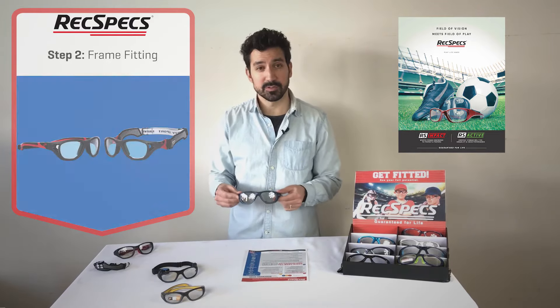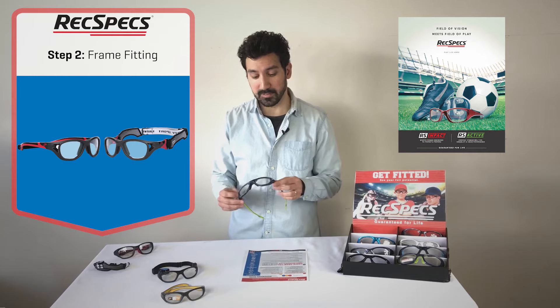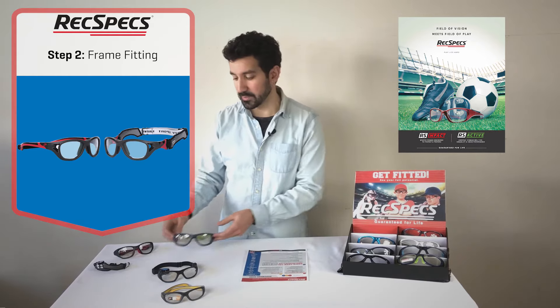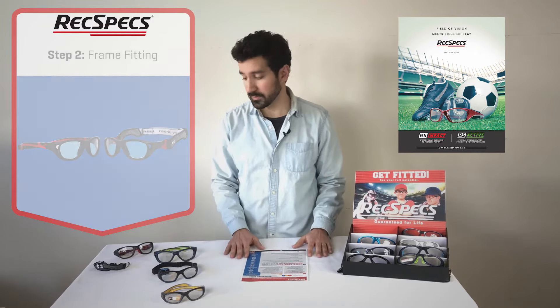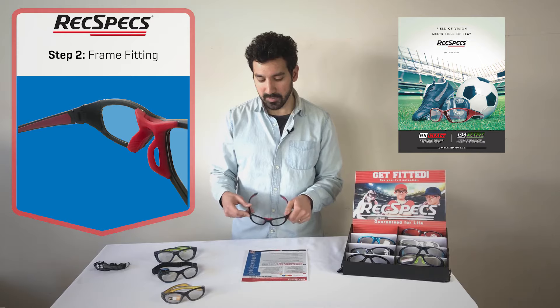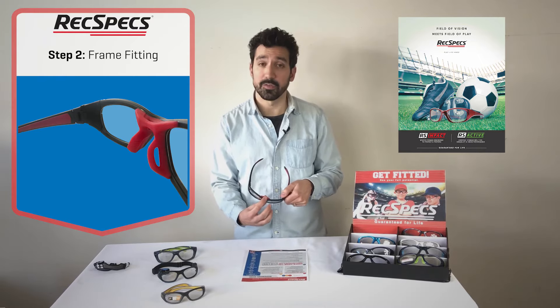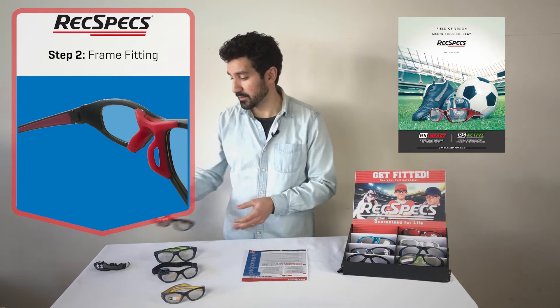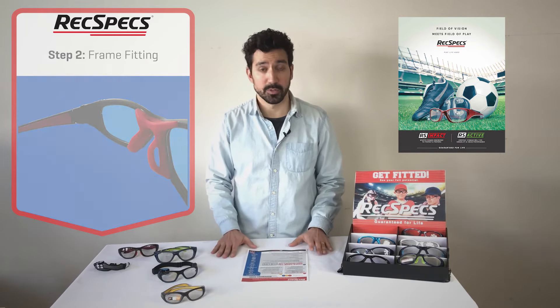Here we have our interchangeable style. This is quite versatile because it serves as both a frame and a goggle for patients that participate in multiple sports. And then lastly here we have our low bridge fit. This has raised padding here around the nose bridge which actually helps keep these frames propped up on your patient's face, especially if they have a lower nose bridge.